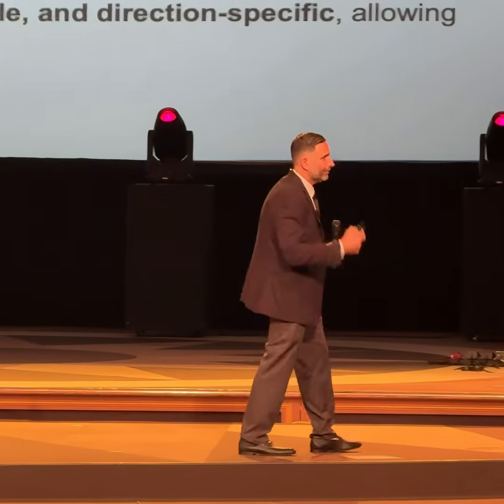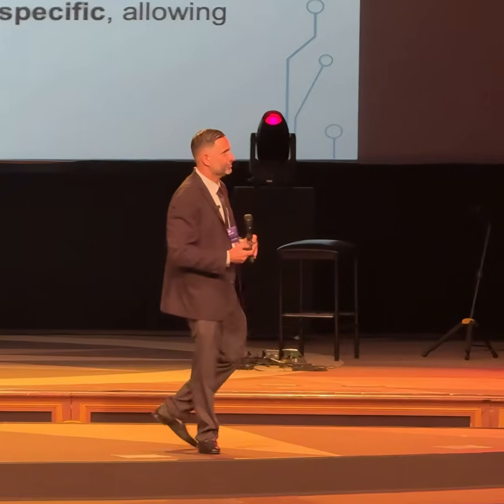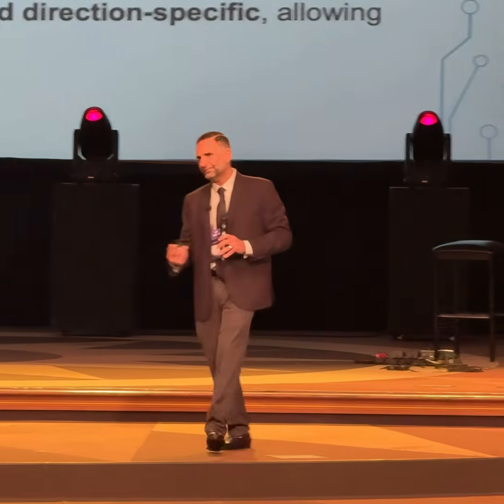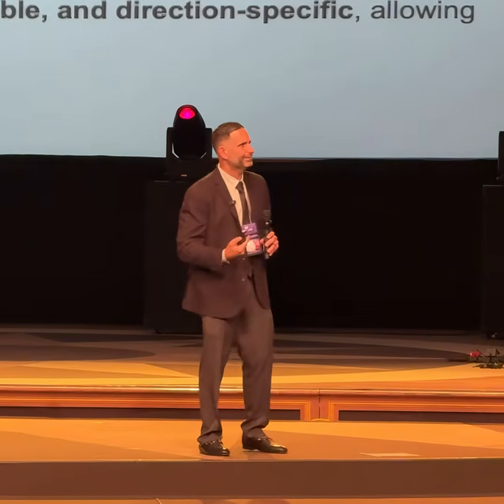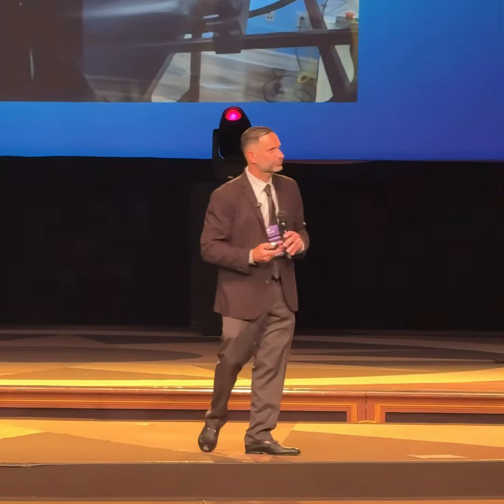The stimulus is graded, repeatable, and direction specific. That's why I like the multi-axis chair, because it's really going at the same speed always, consistently. But again, you can use a chair. So this is a multi-axis rotational chair.